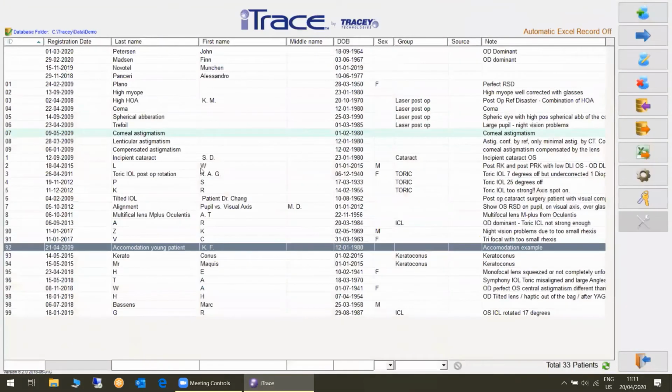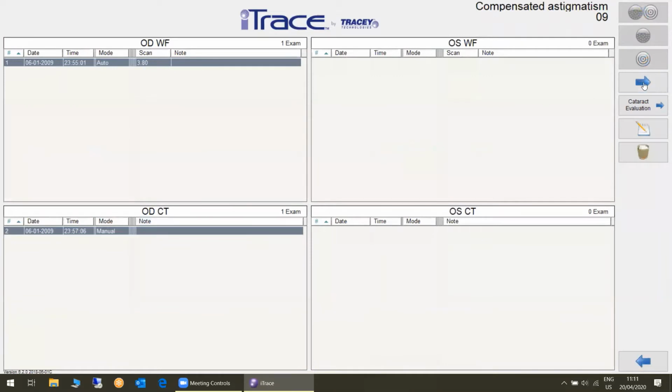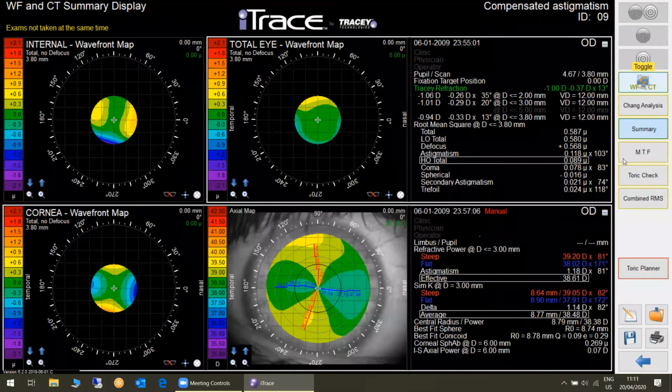So let's go back, and this sometimes can explain patients who are young and they have headaches. They don't wear glasses, and if you see that they have a negative spherical aberration, please measure them in cyclorefraction. They could have an accommodative spasm. Or people that you want to do laser vision correction on. If you see that this is negative, please measure them in cyclo.